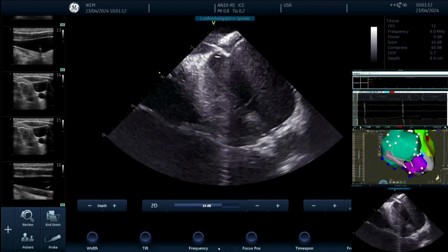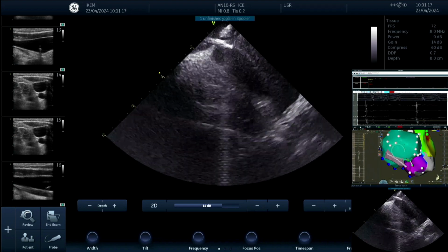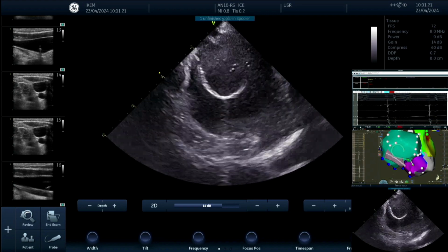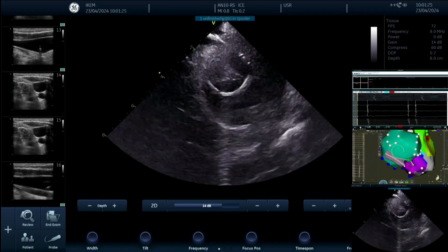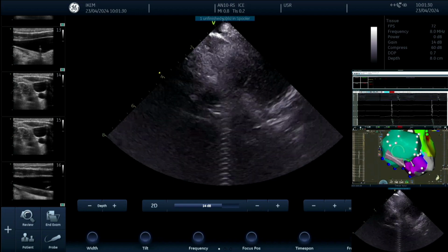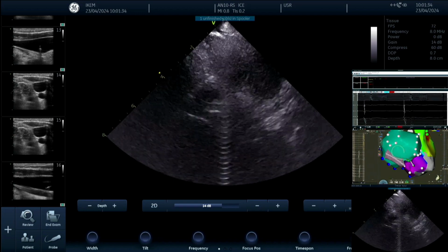So the beauty of extracardiac vagal stimulation is that after every burn you can check the degree of denervation, which to me is a clear endpoint. This is something perfect, completely different from things where you do something and then expect that there will be an effect. Here you can assess the effect after every application.